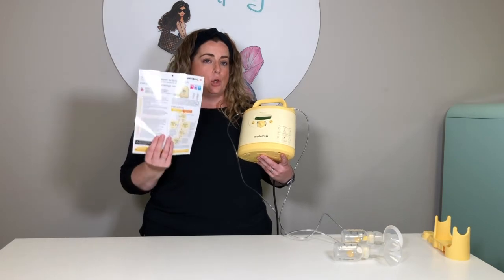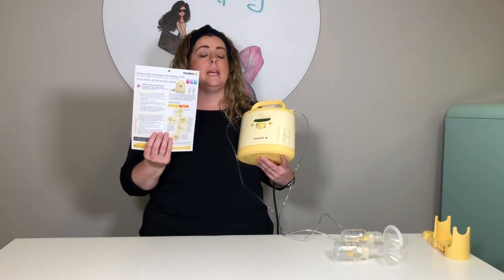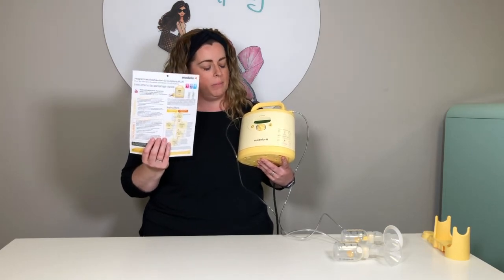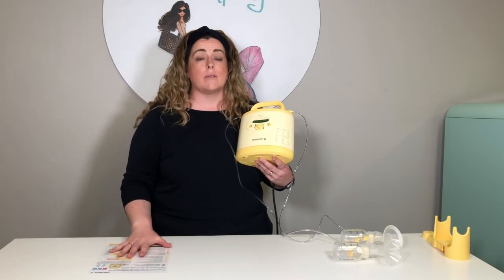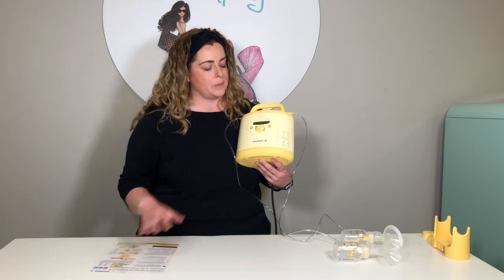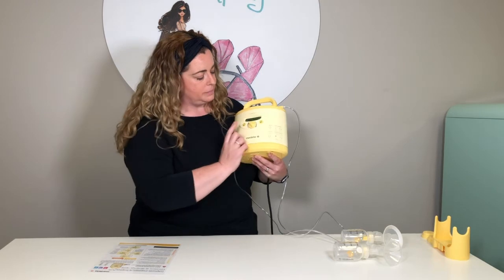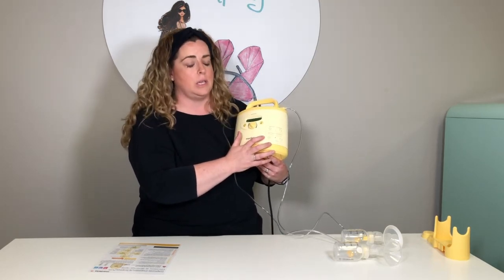Every pump should come with this in the box, or emailed to you if you're renting it from us, or mailed to you with the pump. However, if you don't have these quick start guidelines, they are available online, or we can supply them to you if you're renting the pump with us. This is the initiate button, and as you can see on the side here, there is a little guideline to help you remember how you want to use the pump.